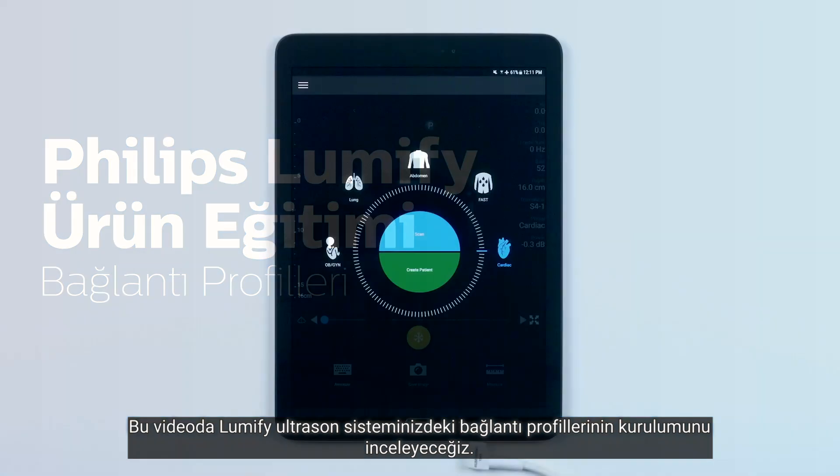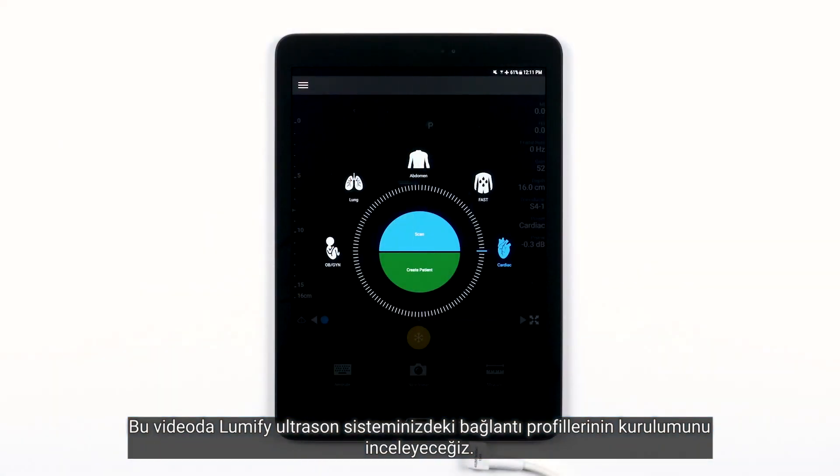In this video, we are going to go over setting up connectivity profiles on your Lumify ultrasound system.